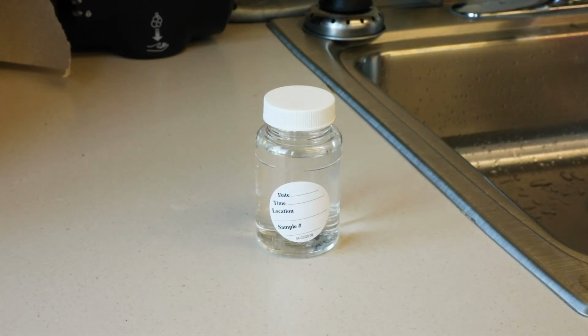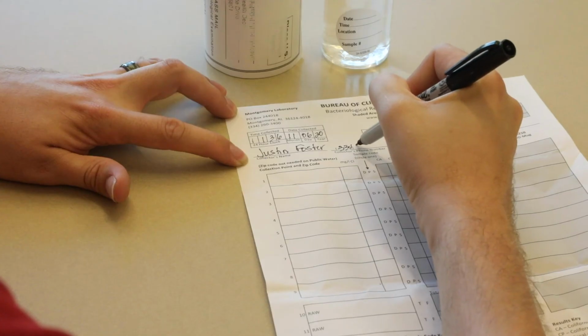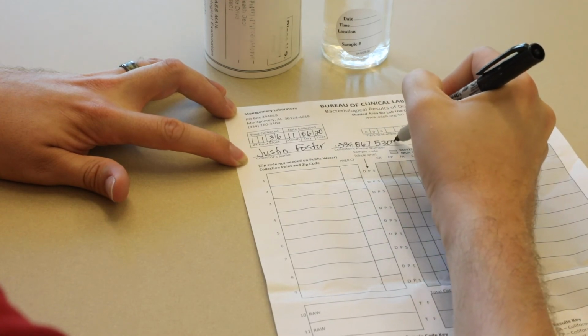After you have collected your samples, place the bottles in a cool, dry place. Make sure to fill out all the appropriate information on your sample log so that the correct tests are run. Again, make sure to only sample on Monday through Wednesday to have the most accurate test reading.